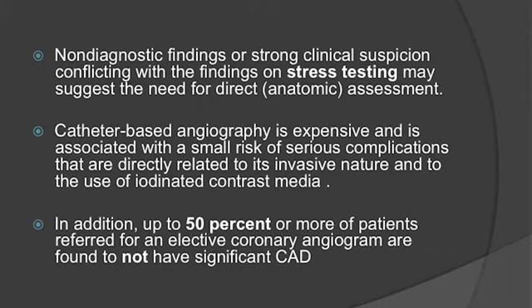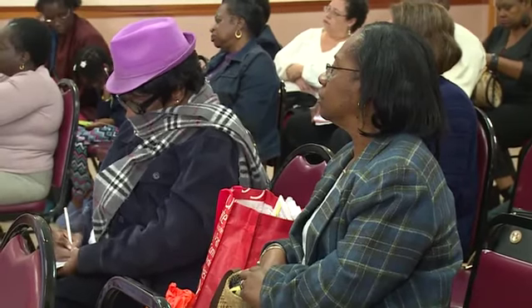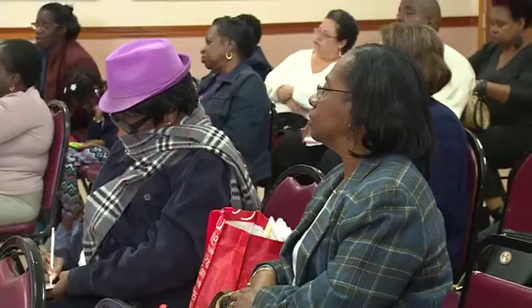So it's important to know that a lot of times when a patient is scheduled for a catheter angio, 50% of the times there is not significant disease, which means that an invasive procedure, which entails its own set of risks, admission, anesthesia, overnight stay, is being done for no findings. And that's where the screening tool, which is non-invasive, becomes important.